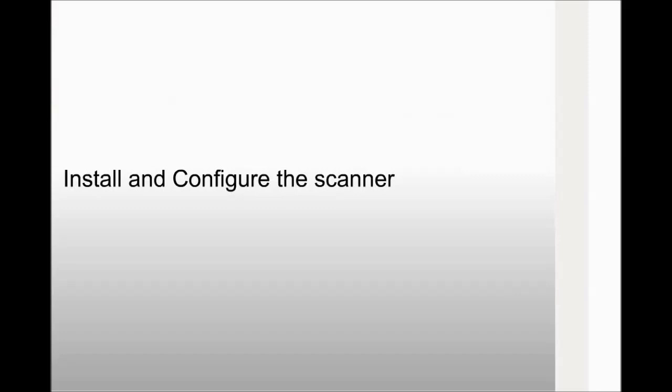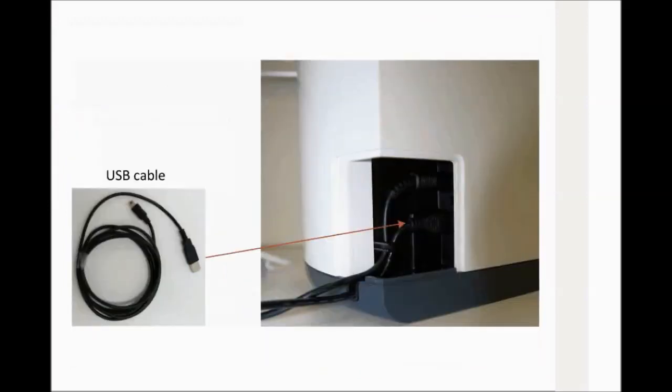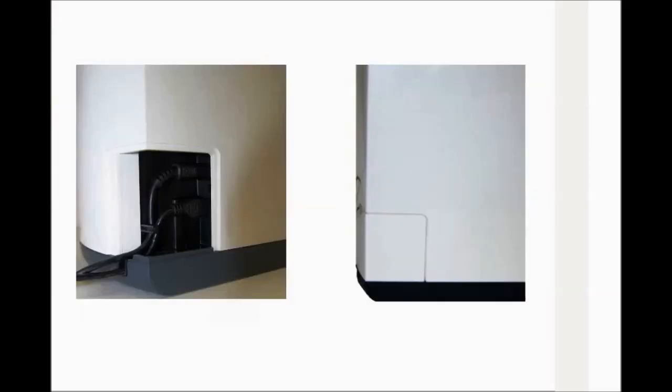Install and configure the scanner. Connect the power supply cable to the power supply inlet in the cable compartment, and route the cable as shown to secure it in place. Connect the USB cable to the dedicated connector in the cable compartment, and route the cable as shown to secure the cable. Close the cable compartment cover.